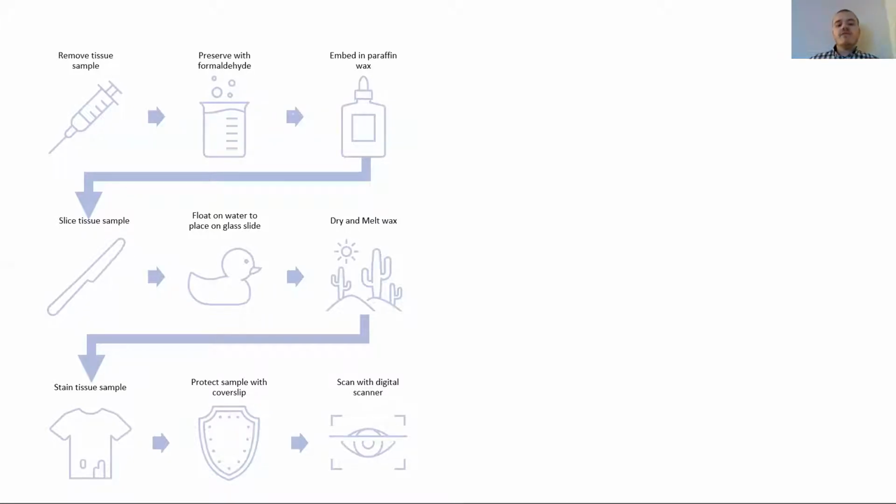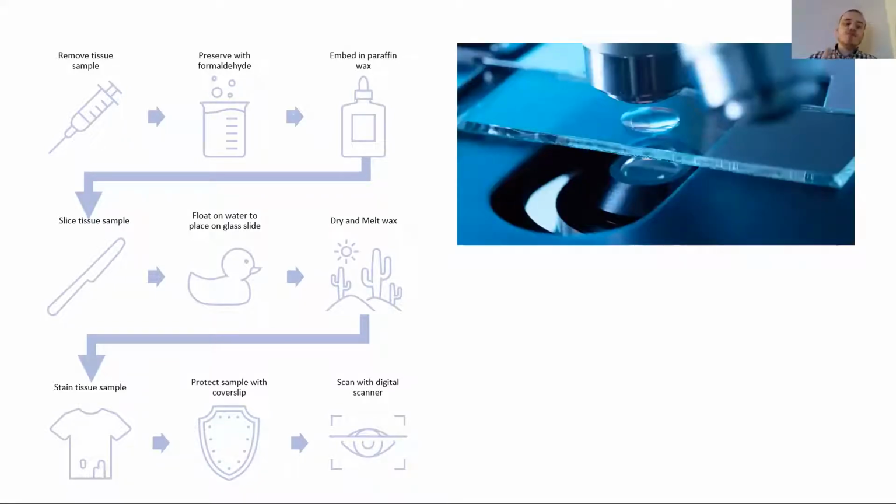So to get a bit of an overview of the general area, when a person has a tumour, a biopsy will be taken. This is then processed via a complex set of steps, and it eventually turns into a microscope slide that can then be viewed by a clinician. And this allows a clinician to get more information from a tumour, for example, the tumour stage, aggressiveness, spread, and cancerous tissue change.